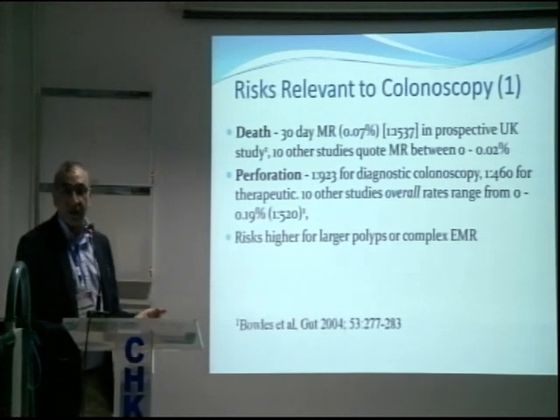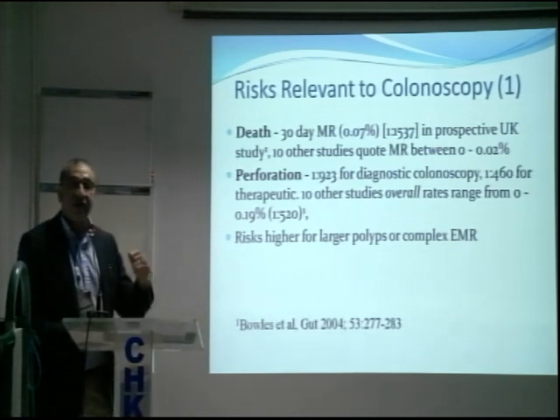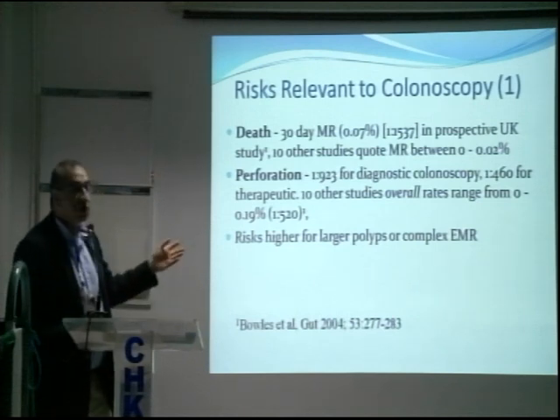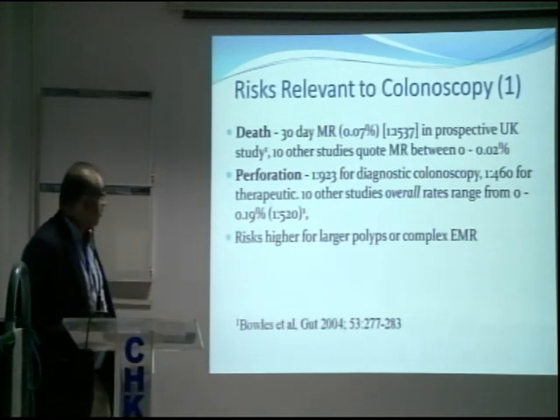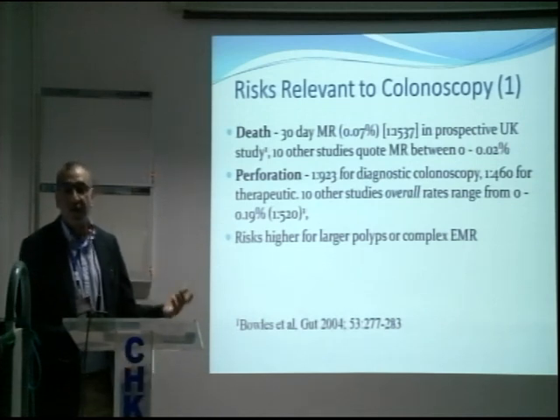Perforation is a very well-recognized complication, and its incidence depends on your skill levels, on the comorbid factors, and what procedure you are carrying out. Perforation is highly unlikely in a diagnostic colonoscopy in a healthy patient. It is usually the result of a therapeutic procedure or other coexisting factors in the colon, like diverticular disease or acute severe colitis, conditions in which one has to be careful. The incidence of colon perforation in a diagnostic procedure is about 1 in 1,000. It varies a bit from the various series that have reported it, but 1 in 1,000 is a safe figure that you can use.